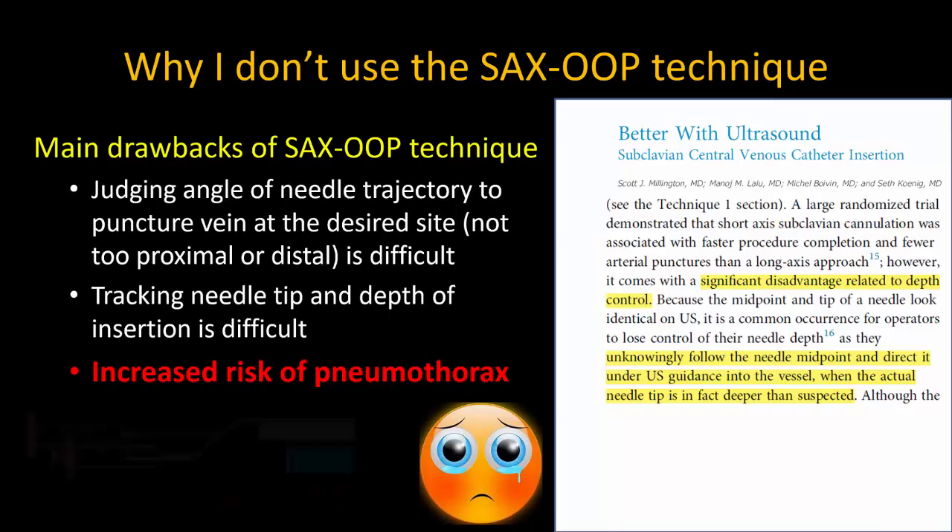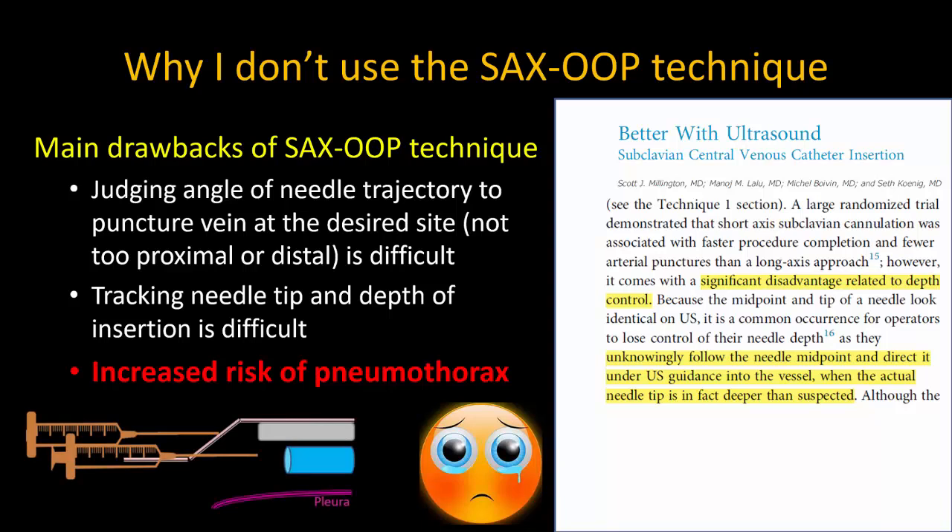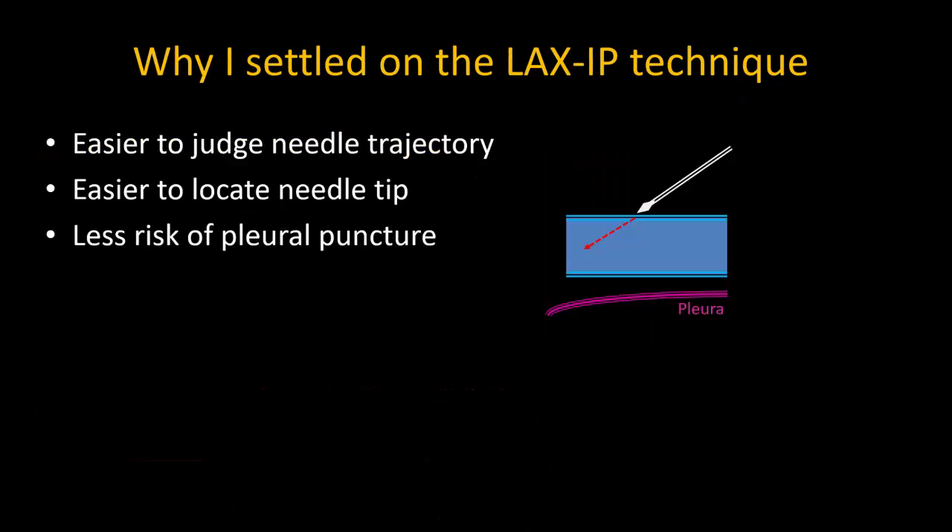Unlike the landmark-guided technique, where I can keep the needle horizontal throughout insertion, in the ultrasound-guided technique we have to angle the needle downwards to reach the vein, which lies deep under the pec major and minor muscles. So the risk of pleural puncture is very real if we fail to localize the needle tip. I have personally found the short-axis out-of-plane approach to be challenging to perform safely. Instead, I turn to the long-axis in-plane technique, which allows me to see and adjust my needle trajectory and track my tip better.